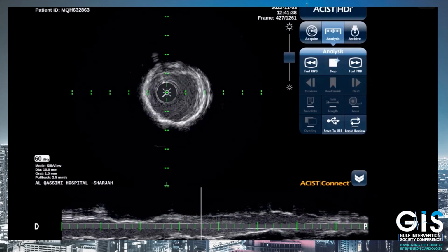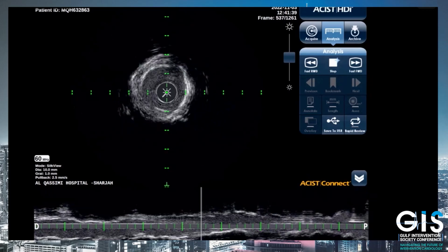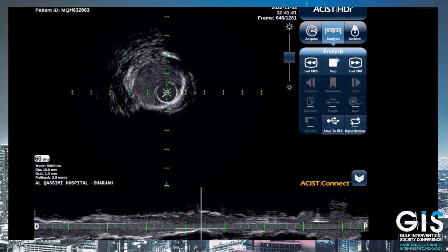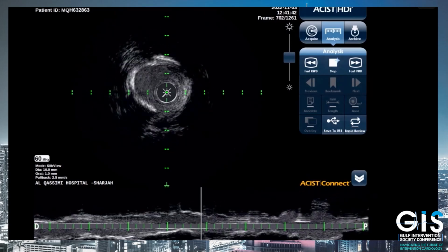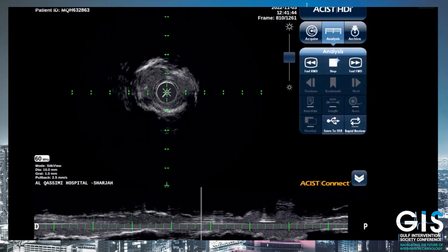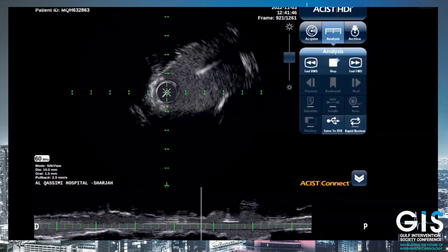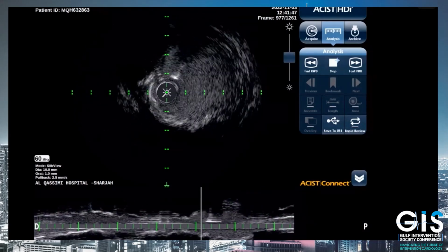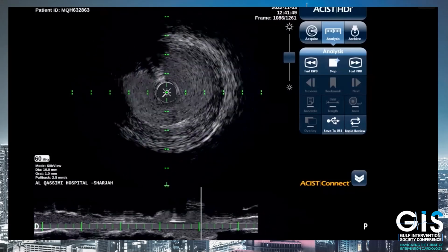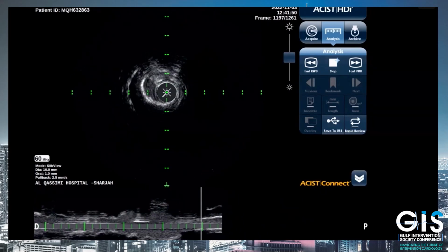4, 22, a second one. We thought that for this angulation, we really need an extremely deliverable catheter and stent. So we thought this is really going to be a good opportunity to use this Frontier with the new delivery system and dual flex balloon. Actually, just to mention, this is the launching of this Frontier in the MENA region. This is the first case in the MENA region to be done. And we thought to keep it for the GIS to have the first case. Come on, Mohammed.